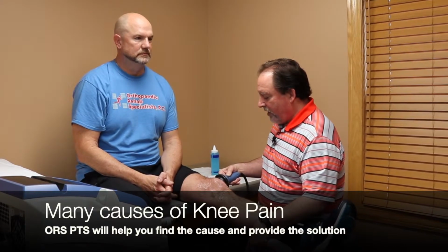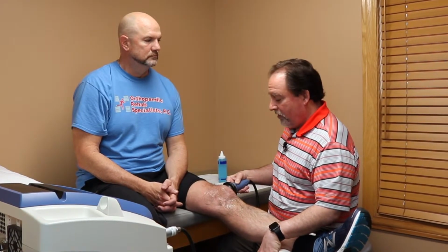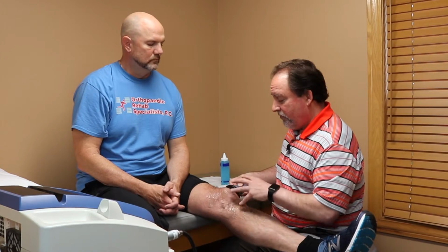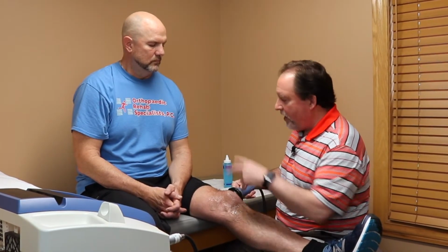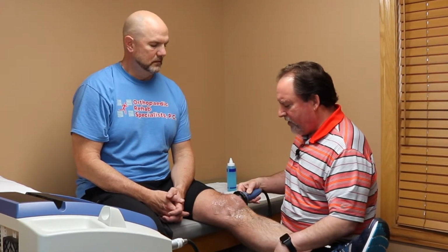There'll be times when I'm working on a spot and they're feeling it in their hip consistently. We may look at the hip. Maybe the hip is causing the knee pain. It kind of shows it. It's a very strange and fun little machine.